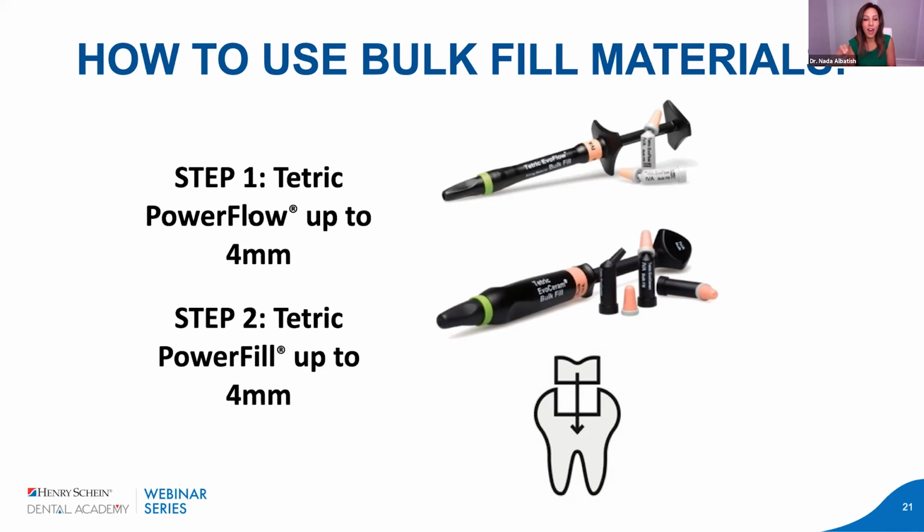These materials have high filler content. They're highly radiopaque, which is incredible. So the flowable and the packable bulk fill materials here are not going to look radiolucent in your radiographs.